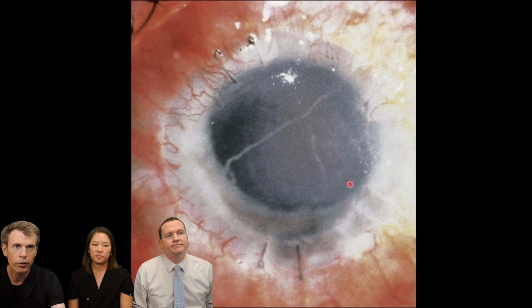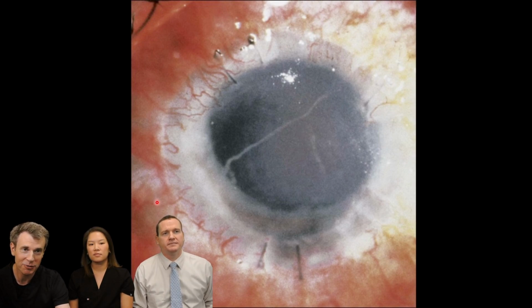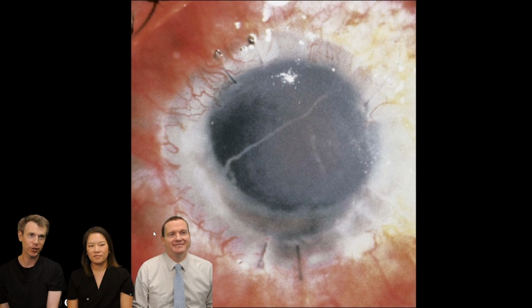So again, remember this picture, where you wanted a summary of the risk of rejection. Loose sutures, exposed knots. This is neovascularization coming in. The more quadrants of neovascularization, the worse. You have a pretty large transplant as well. If you think of this being the limbus, that's pretty close. So large transplant, episodes of prior rejection, loose sutures, and neovascularization. You have it all in this one picture.